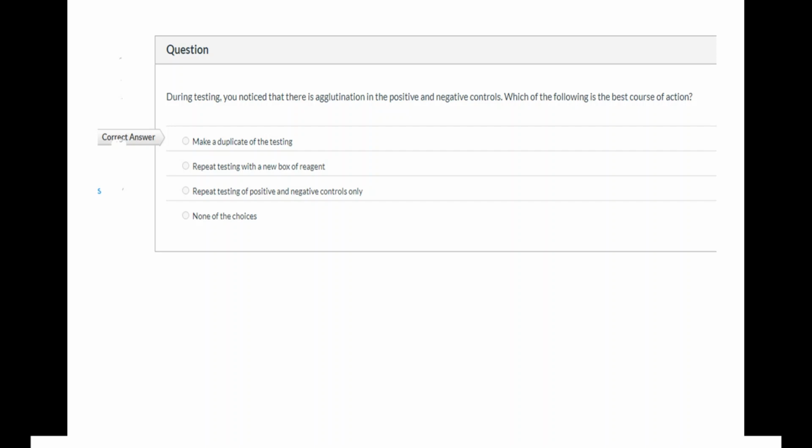But initially, checking should be done prior to performing any testing, right? We perform rechecking of the reagent box for signs of contamination and expiry to make sure that what we used during testing are reagents that are stable. But anyway, after you have rechecked the sample and the box, you are first going to repeat the entire testing.